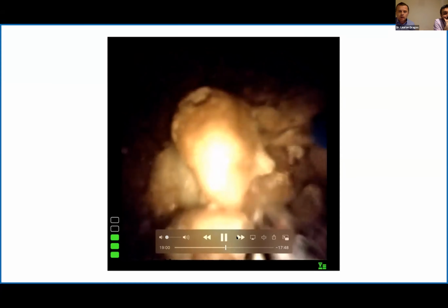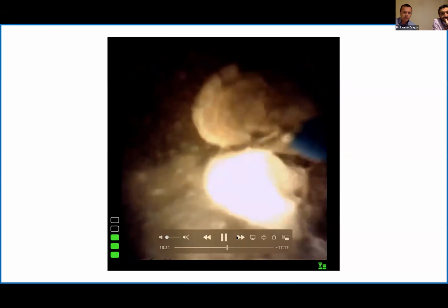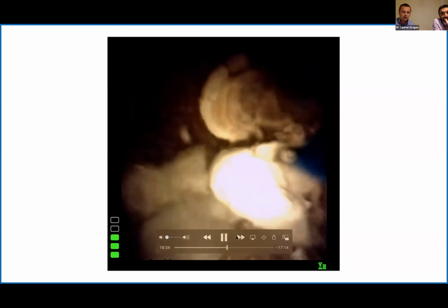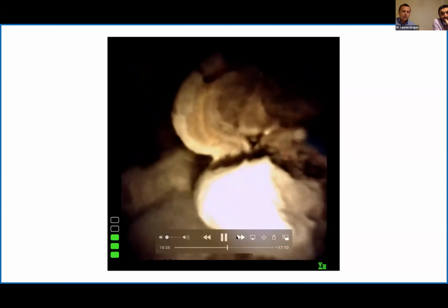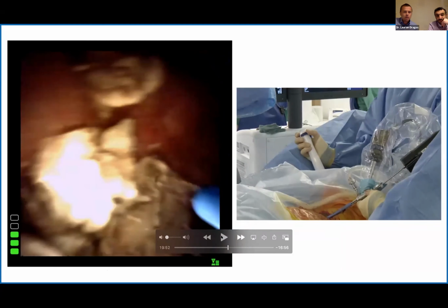I'm pretty sure that at some point someone will ask, or Oli already wanted me to share my opinion regarding the need for high power lasers. Obviously, we all love endourology. We love what we are doing, and it's like driving. If someone loves to drive, obviously, I drive a Skoda. I would like to have a Ferrari. But you can easily do your job with most stones, and I'm talking about stones now, with a 35 or even a lower power machine. That's okay. There are some caveats when you are using the high power lasers, and you have to really know your tools and be quite prudent in some particular cases. But I will stop this comment now.